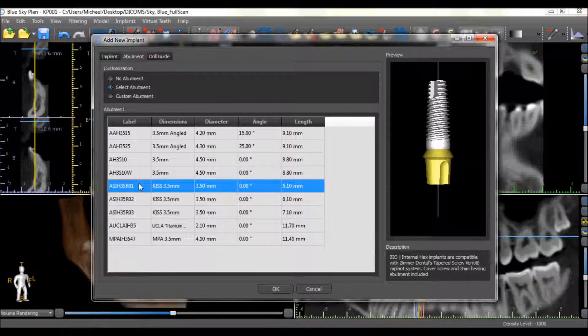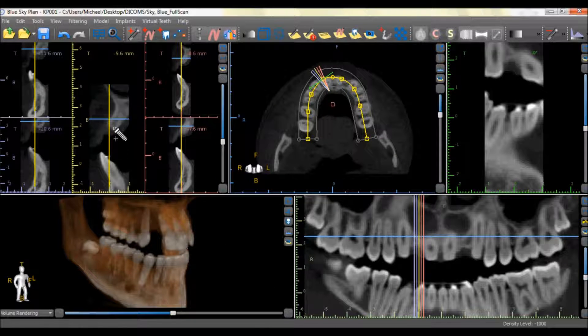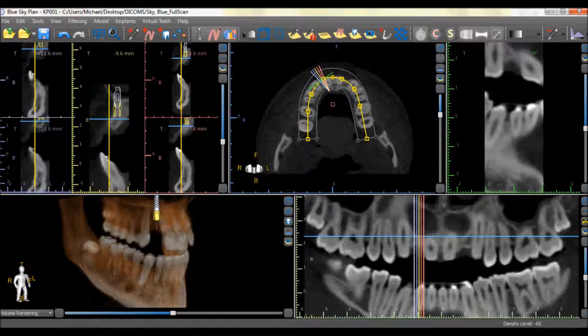After the desired implant and abutment are selected, press the OK button. Left-click in the desired location to drop the implant in its initial location.